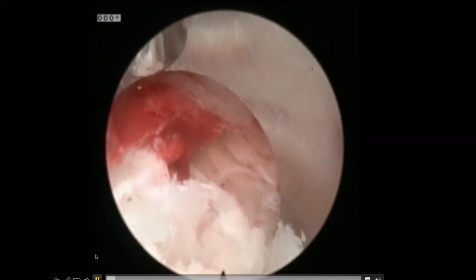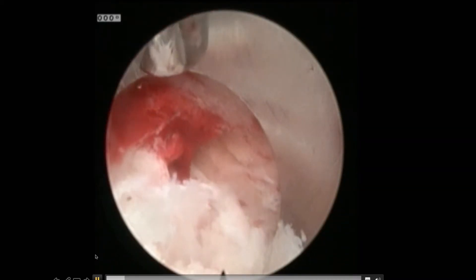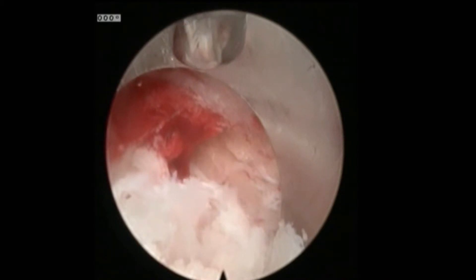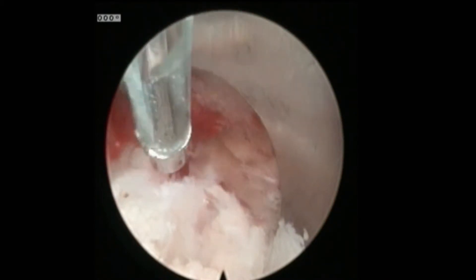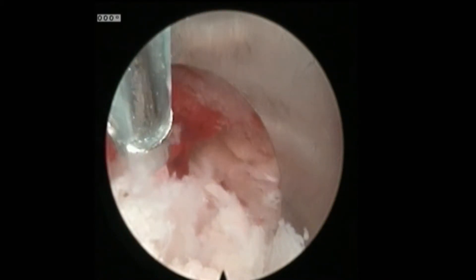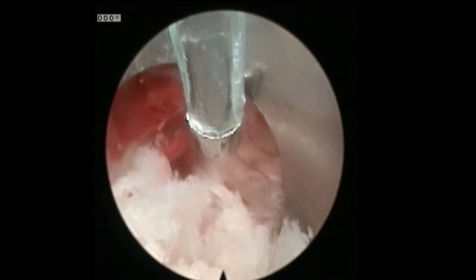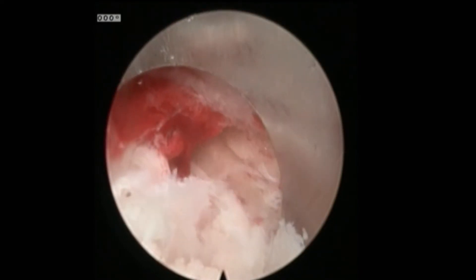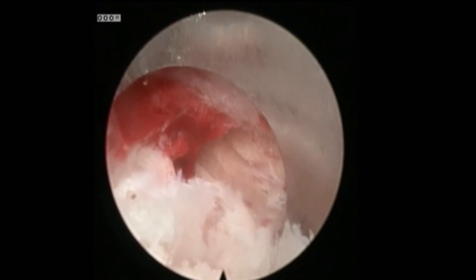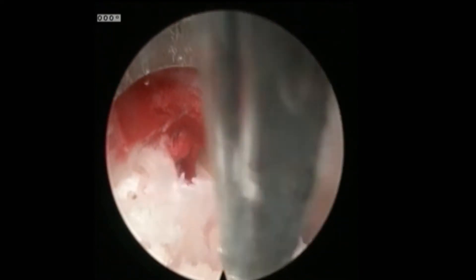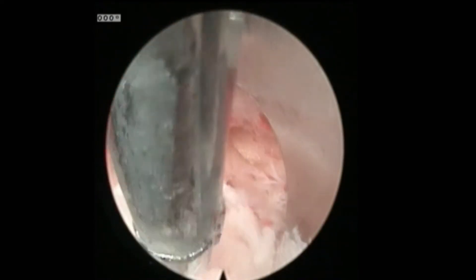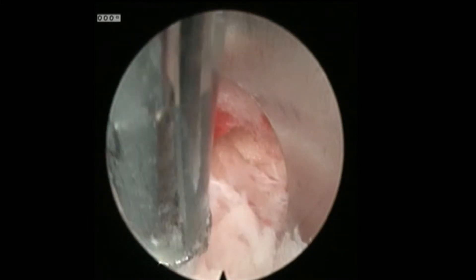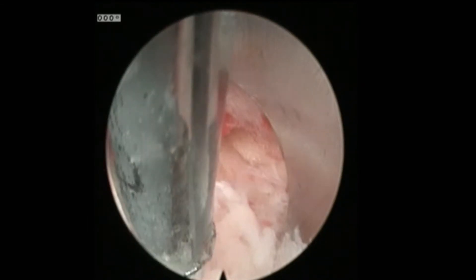Up here at the 11 to 12 o'clock, this is what Dr. Wagner calls a Wagner arch. This is bone that's been resected. You see the pulsating epidural fat right there, and this stuff out here is all lateral stuff in the facet joint, facet capsule.